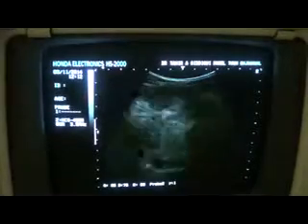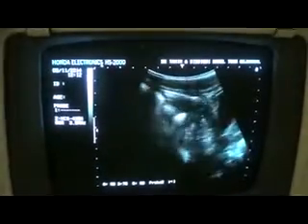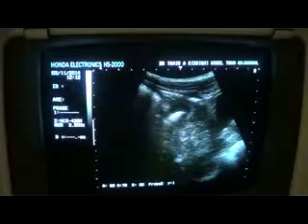And then coming down in the right lower abdominal quadrant, this is the iliopsoas muscle. There is fluid in it, and you will see that the bowels show meager, very slow peristaltic movements. This is the urinary bladder. These are the bowel segments.